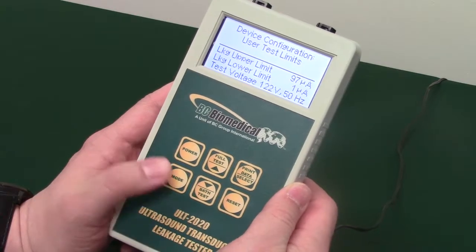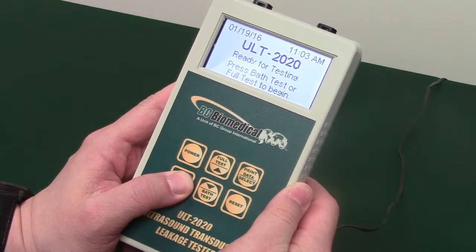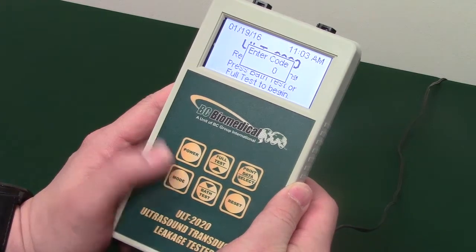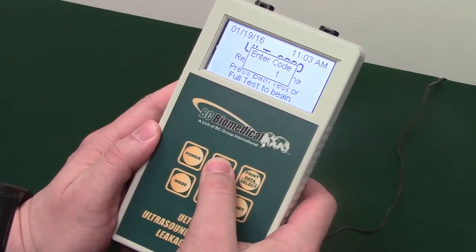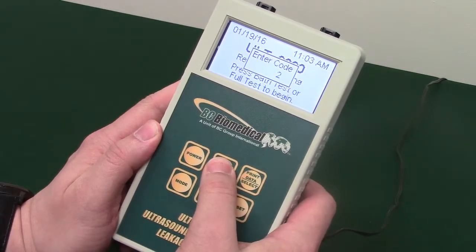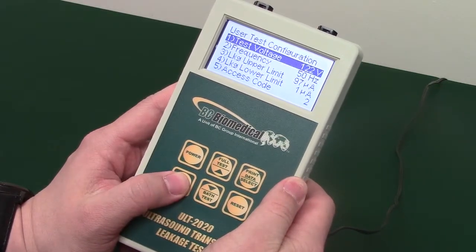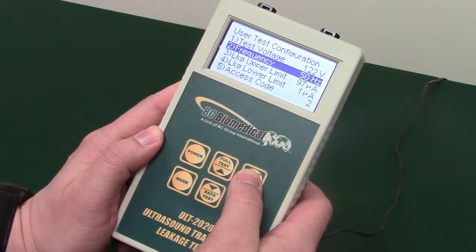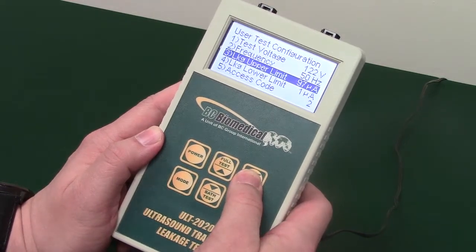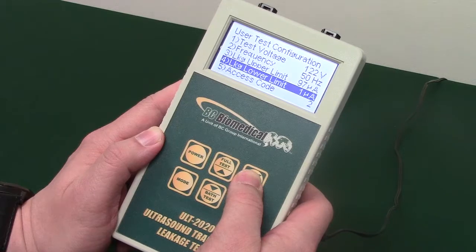To change the user limits, hold down the mode button until 'enter code' appears. Use arrows to scroll to 2 or your set password. There are five settings a user can adjust: test voltage, frequency, leakage upper limit, leakage lower limit, and access code.